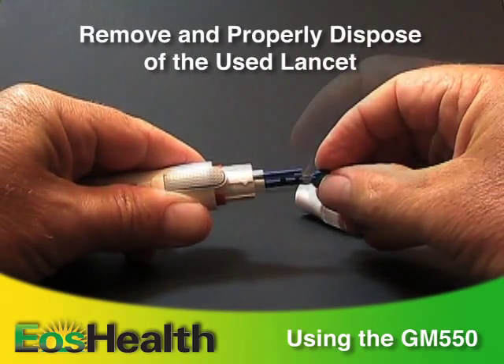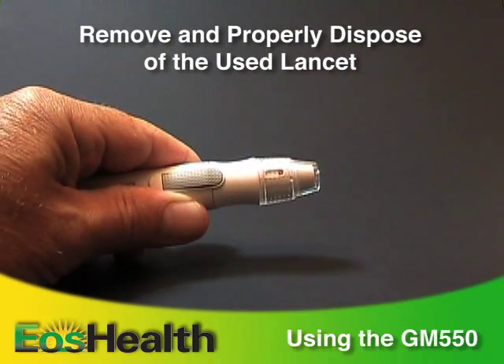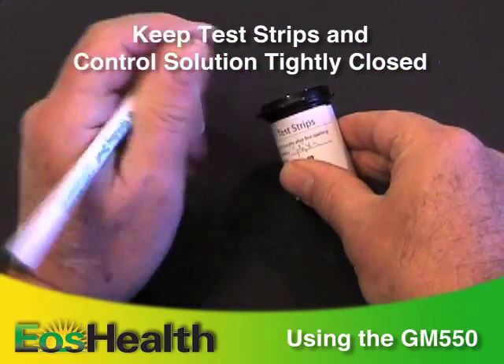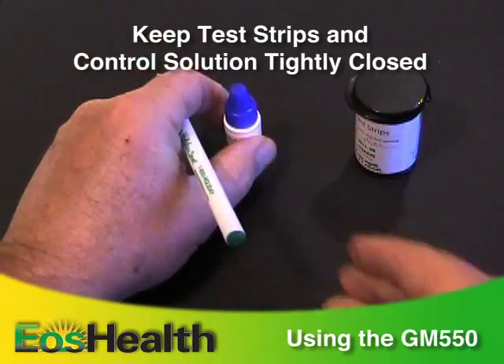Here are a few tips. Always be sure to properly dispose of the used lancet and replace the cap on the lancing device. Always tightly close the package of test strips and the bottle of control solution. Both are good for about 90 days, so write down the date that you opened the package.